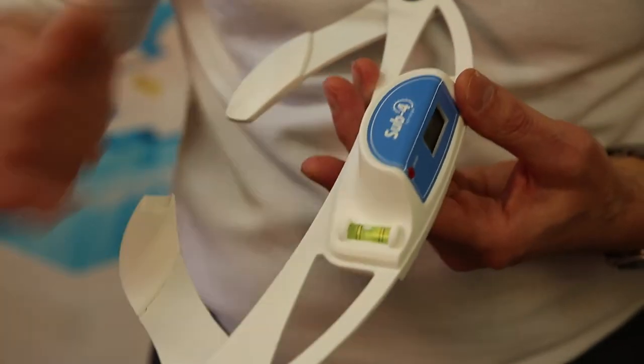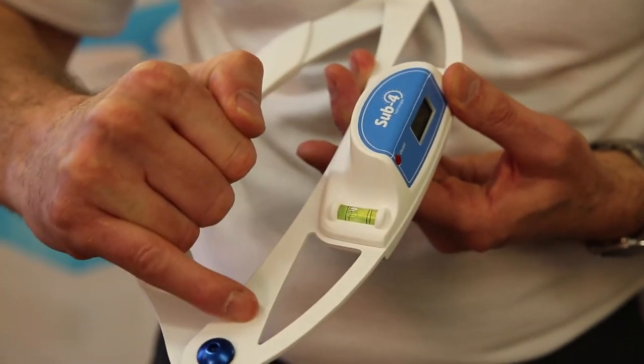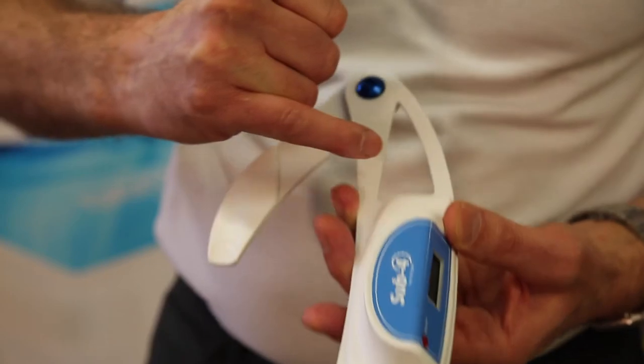The spirit level on the side gives you a horizontal reference point so that when a reading is taken from the side of the pelvis you can maximise accuracy.